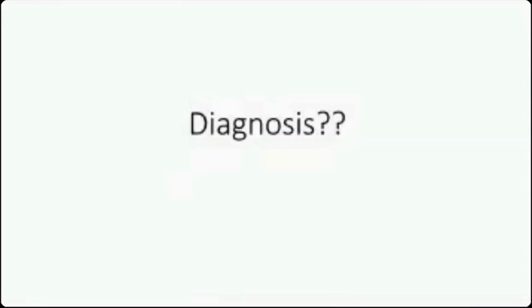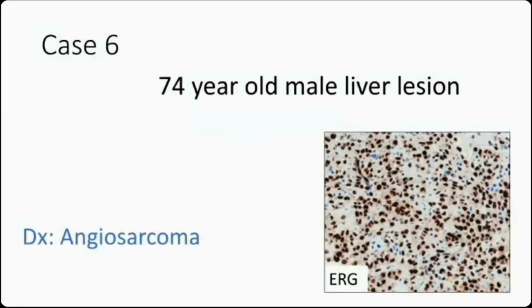Anyone want to make a diagnosis? The macroscopic description, I was saying how important macroscopy is. The macroscopic description is quite classical for these lesions. Okay, so yes, thank you, Heather. This is an angiosarcoma, and this is the ERG, which is a nuclear vascular marker.